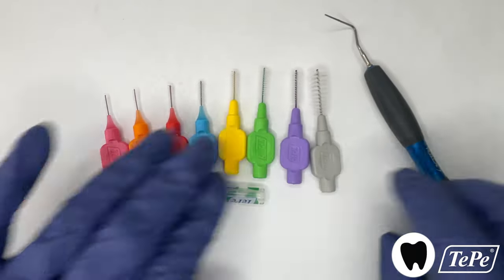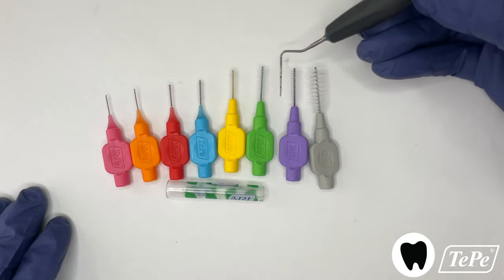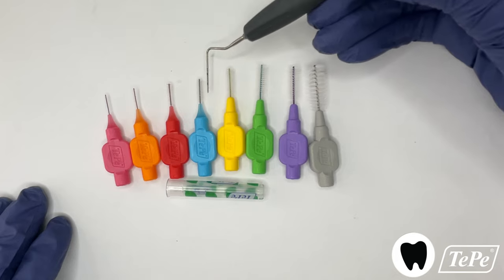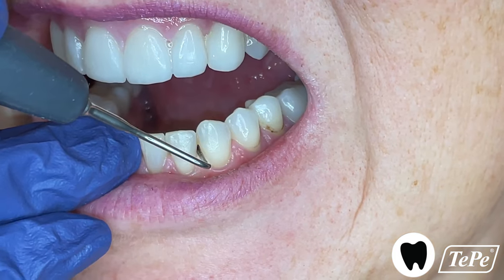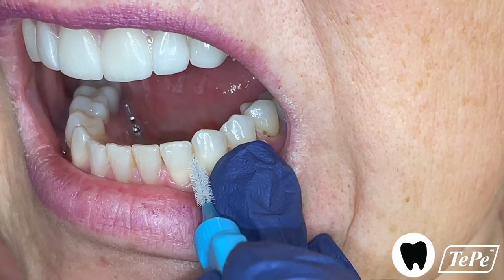First, help the patient understand which size or sizes are right for them. You do this by using the diameter of the probe as a sizing indicator. The probe is the same circumference as the middle or central wire of the Tepe blue colored tip. To measure in the mouth, test if the probe passes through the embrasure space. If it lightly touches the teeth around it, as it does here, then the blue tip is the perfect size.